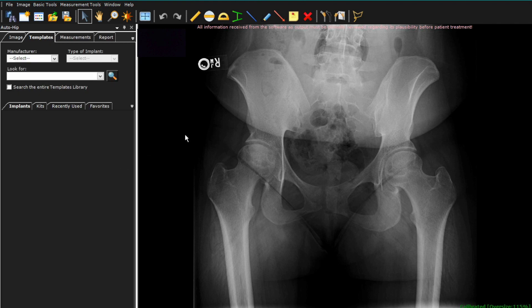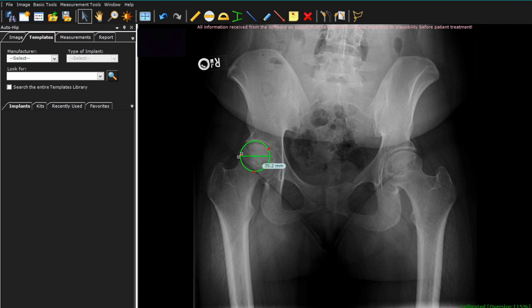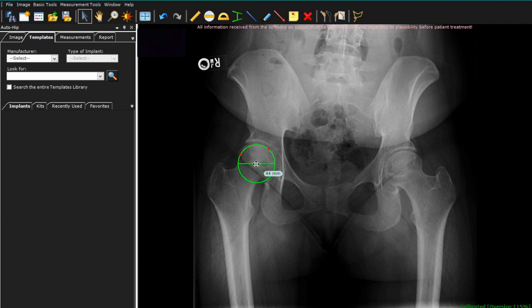We go on to select the circle tool, and I will drop the circle tool and measure the femoral head. This is helpful intraoperatively. I'll then move this out of the way where it's not over the hip of interest.